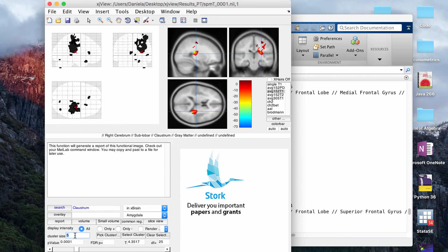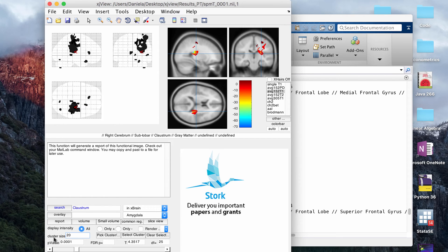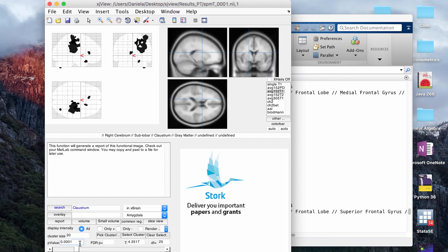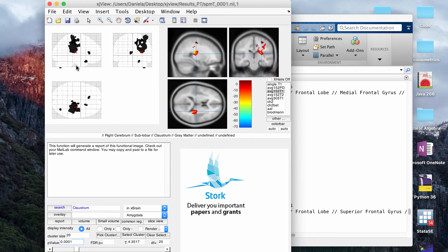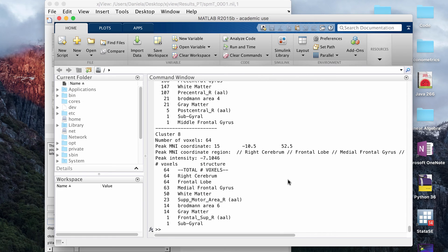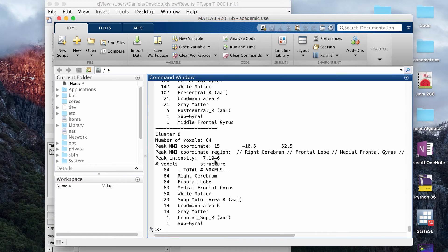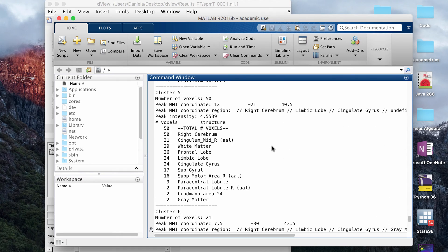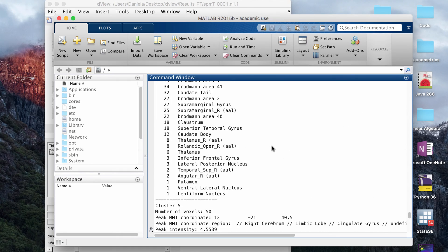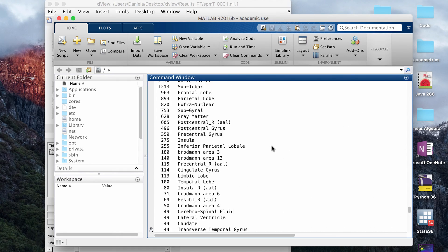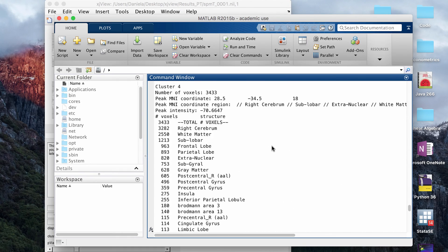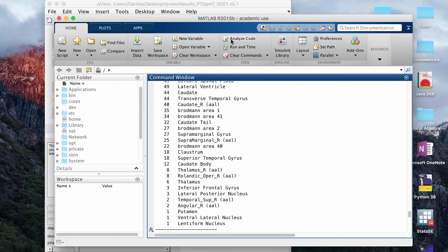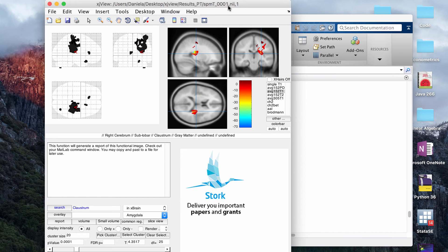You can also say that a cluster has to be at least, let's say, 20 contiguous voxels. If you click and change the cluster size here and make it more stringent, then that will also get rid of some of the clusters. Now if you click report again, and we look here, now it's only picking up eight clusters, and the information has changed a little bit because some of the smaller, more insignificant clusters have been removed, so that's really useful as well.